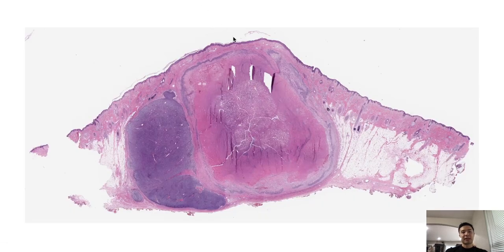So this is a different case, but thank you to Path Library. Usually I try to do this blind, but I already looked at the answer. But from afar, you can see like a granuloma with necrosis. Actually, you don't know if it's necrosis. It can look red. It's red. We know that. So this could be like a rheumatoid nodule where it's like fibrin.